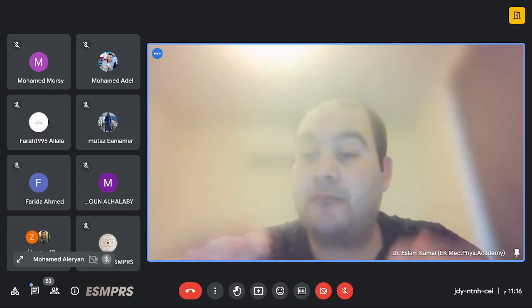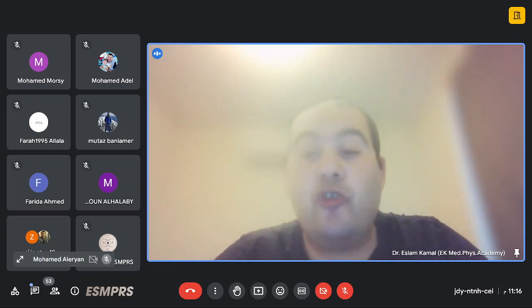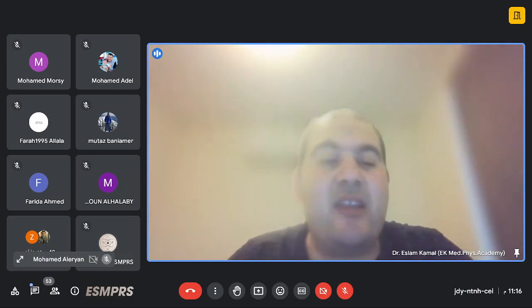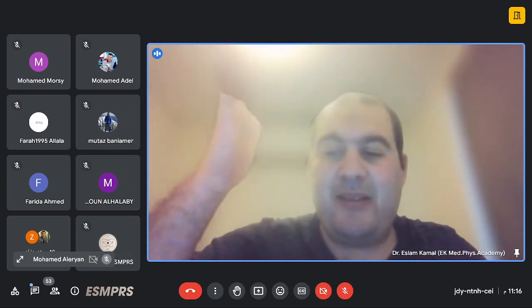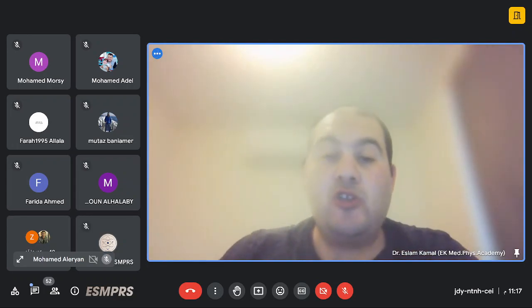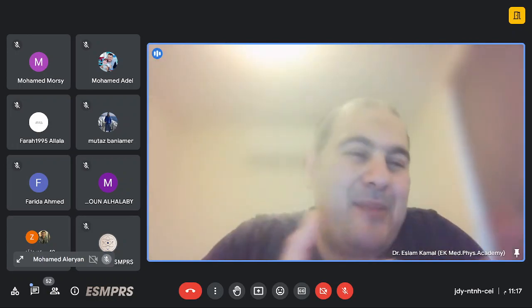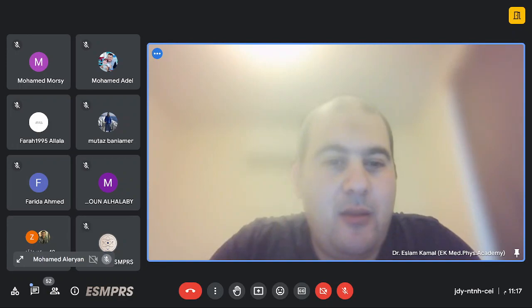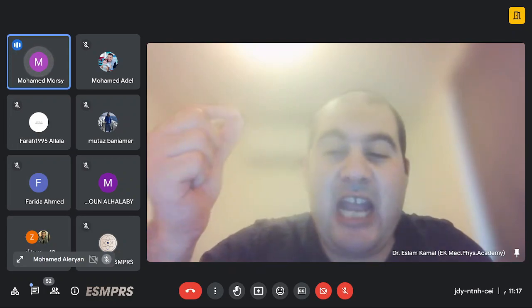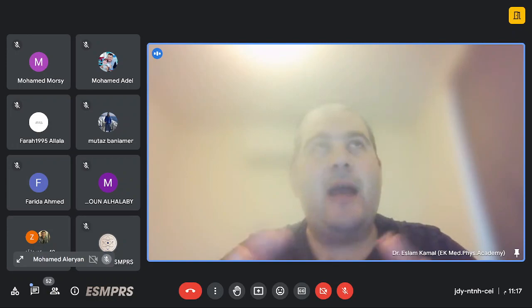تمام. طيب جه بعد كده قال لك انا هطلع الانفيرجن ريكفري. هتقول لي الانفيرجن ريكفري يا دكتور اسلام، انا بشتغل على السبين ايكو بس بدي 180 ديجري بالز في الاول، يعني بدي 180 90 180، او بكمل السيكونس بتاع السبين ايكو. سؤال حضرتك اللي انا فهمته وصحح لي اذا كنت غلط، ليه انا بعمل السيكونس الجديد؟ مظبوط يا دكتور. احنا ليه عملنا الديفرنشيشن بين الحاجات دي كلها؟ السيكونس الجديد.